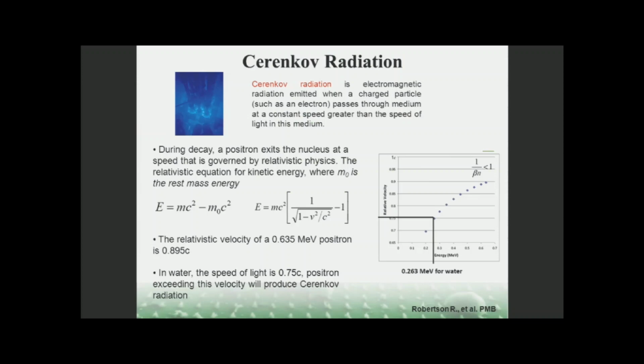So you take advantage of Einstein's energy and speed equation: for a certain radionuclide that emits a particle with a given energy, you put that energy in and calculate the speed.